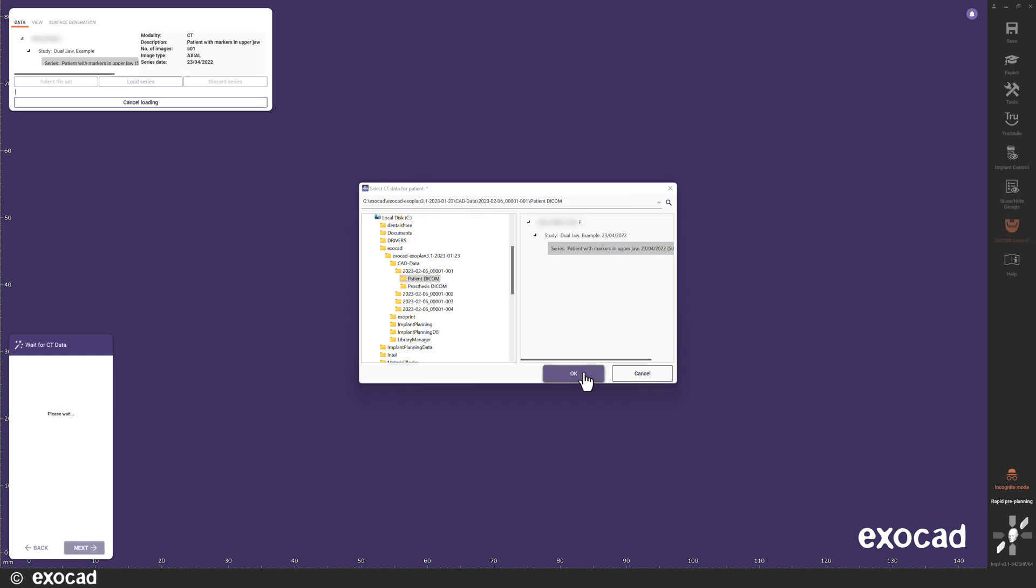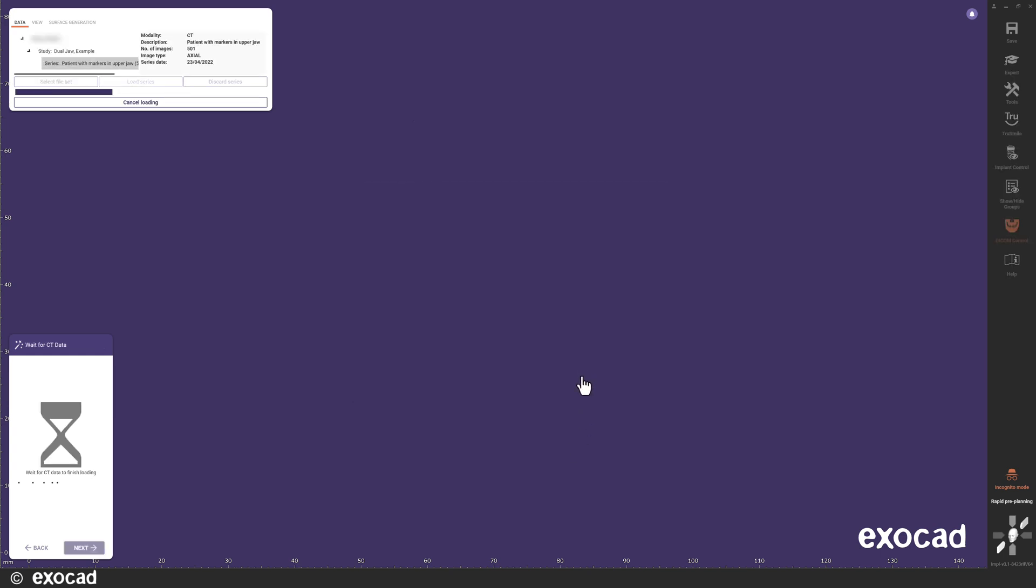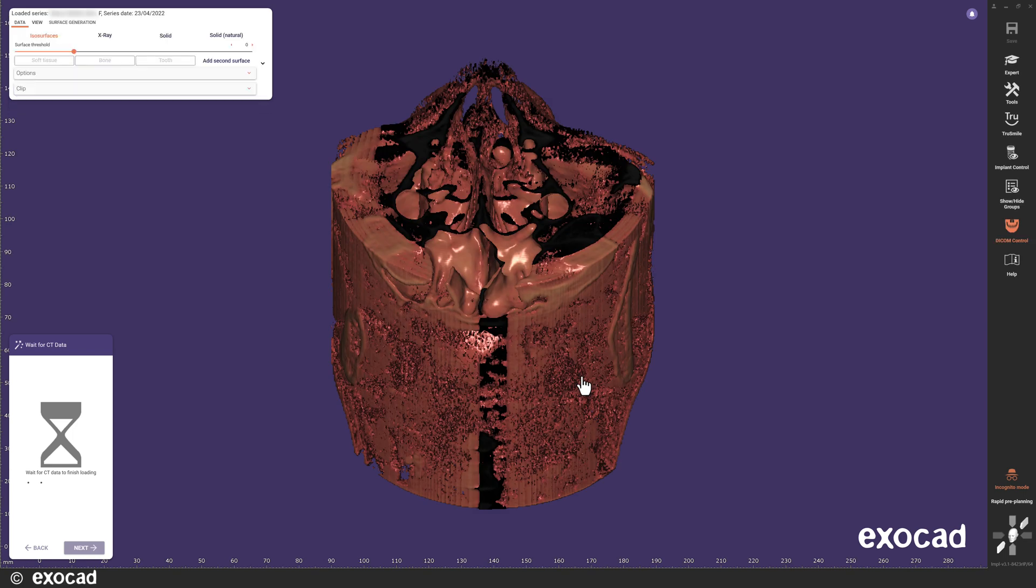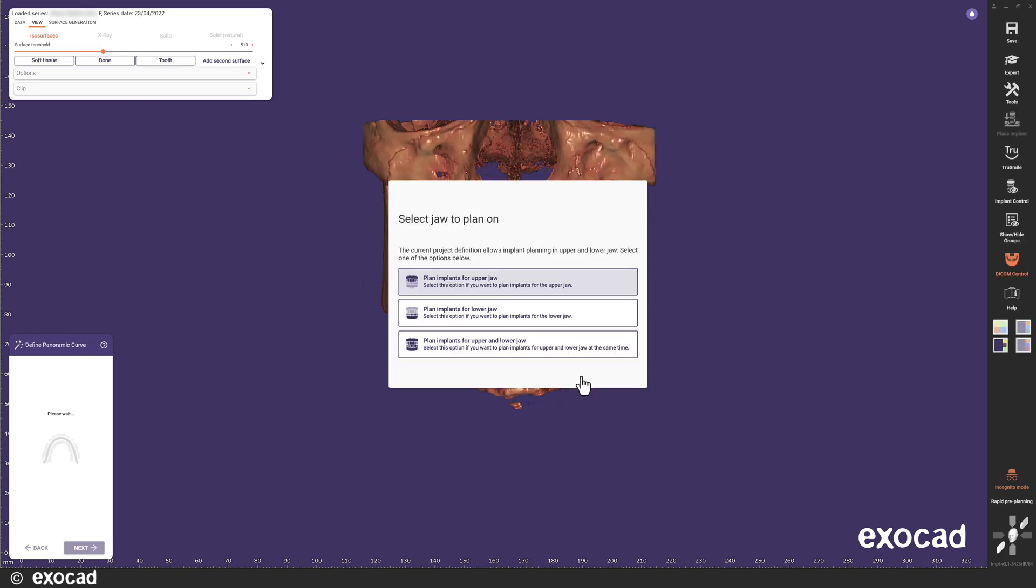Since I have defined implant sites in both upper and lower jaw for this case, the software wants to know which jaw I want to work on. As I mentioned in the beginning, it is now possible to work on both jaws at the same time, and I will select that option.